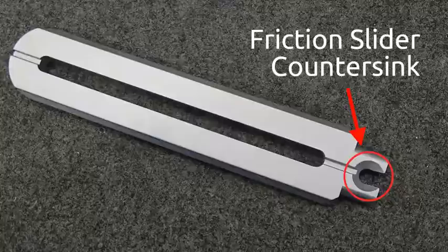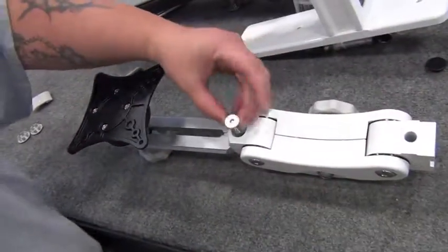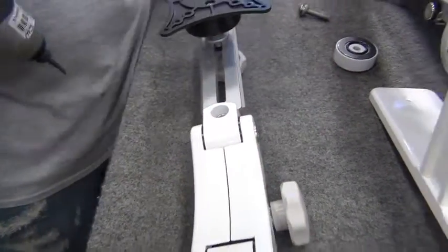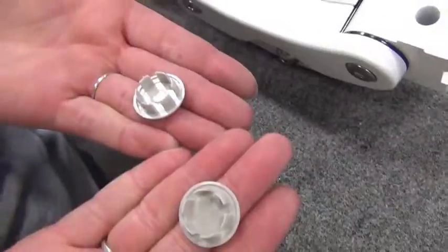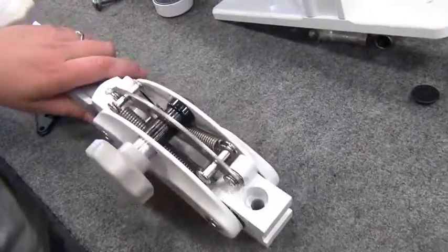Insert friction slider into the Paralink with the countersink side up. Fasten the friction slider and Paralink together with a 5/16-18 by 1 inch flathead socket cap stainless steel screw. Snap 11/16 beauty caps into the front and back holes of the Paralink, then attach the ICW beauty cap.